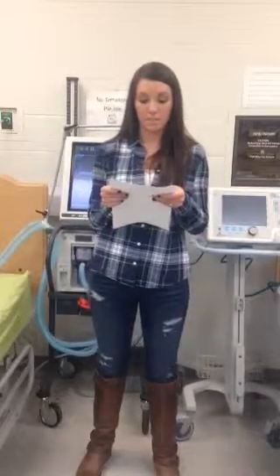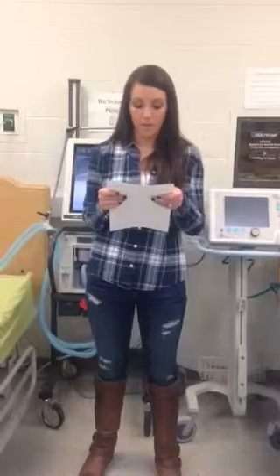After sharing these findings with Dr. Chrisman, we decided she needs immediate BiPAP therapy to assist her spontaneous breathing efforts. I decided to use a full-face mask because she is an obligate mouth breather and she is in distress.